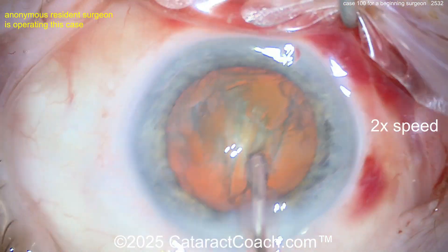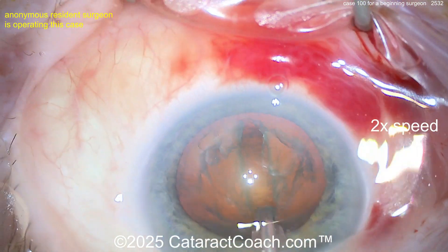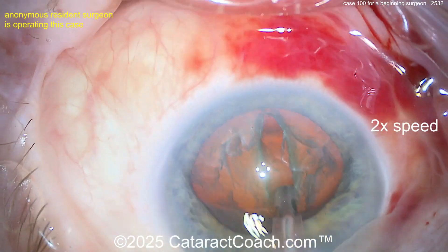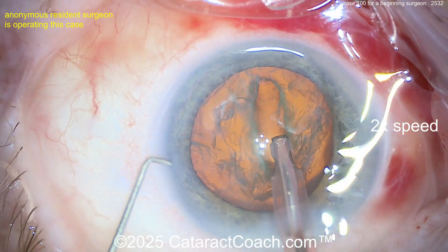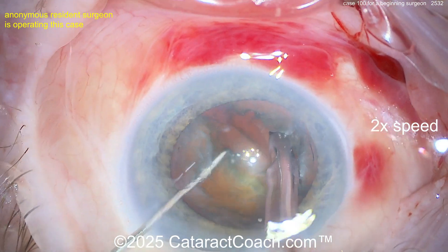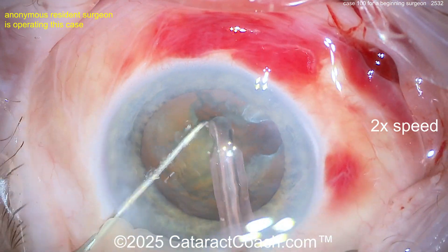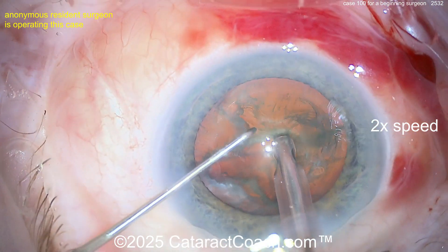We already saw the title — there's going to be a groove. There's the groove, looking good. I like to get a little more sub-incisional with the groove, but you're doing a pretty reasonable job. There's the sub-incisional area. Now get the eye back in primary as you go down. That's a reasonable groove — you can split right away. Instruments down in the groove — there's a split propagated all the way through. Good rotation. Divide and conquer — another groove, split up into quadrants. That's reasonable for case 100.